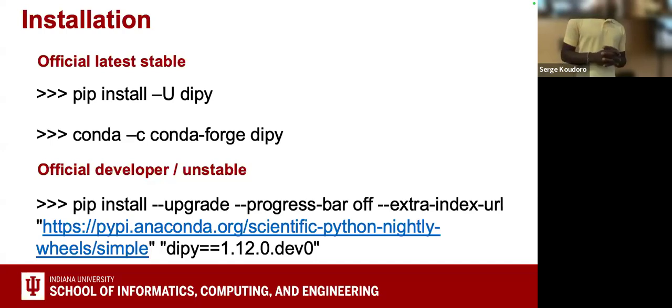That's quite exciting, but you could also have the latest bugs, that have not been checked. So if you are not comfortable with developing, I wouldn't recommend installing the developer version. But if you want to have really the latest and you know what you are doing, feel free to install it. And it's updated every two days, so it's really convenient.